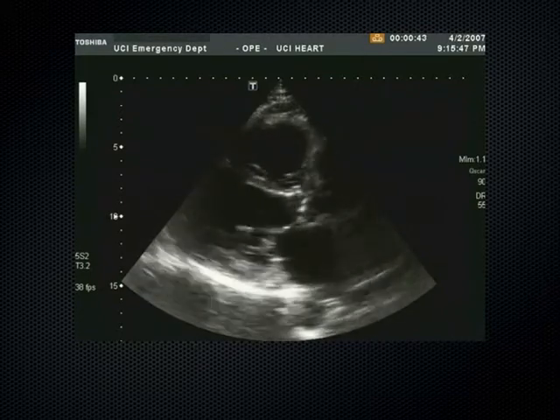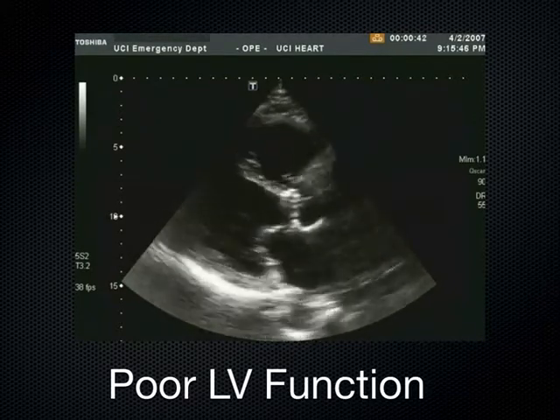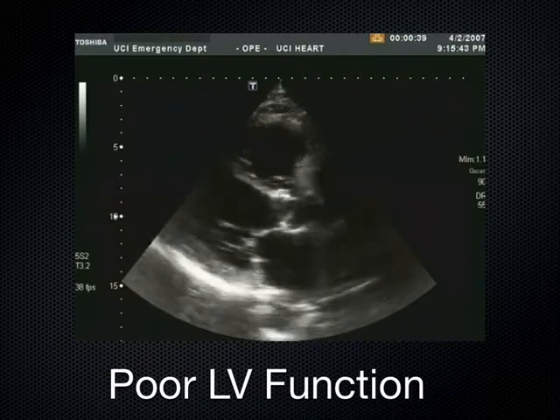Medications or fluids? Medications, very good. Excellent. Any questions before I leave kinesis and move on to Doppler color?